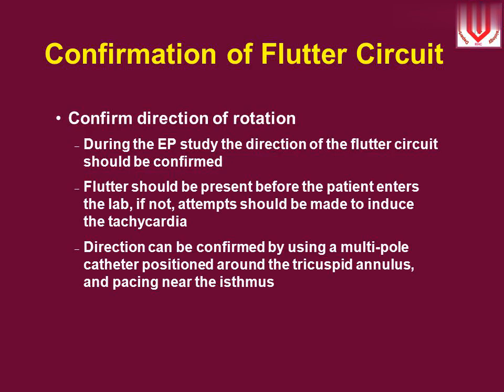Confirmation of flutter circuit. Confirm direction of rotation. During the EP study, the direction of the flutter circuit should be confirmed. Flutter should be present before the patient enters the lab. If not, attempts should be made to induce a tachycardia.